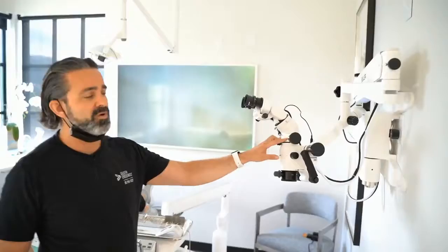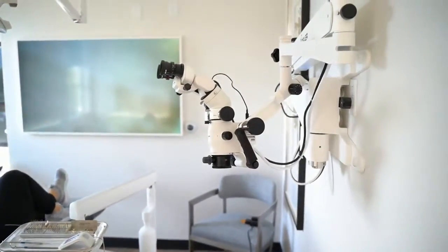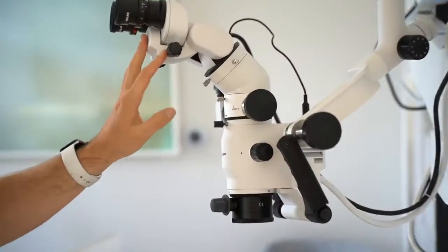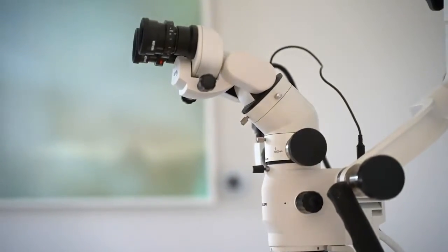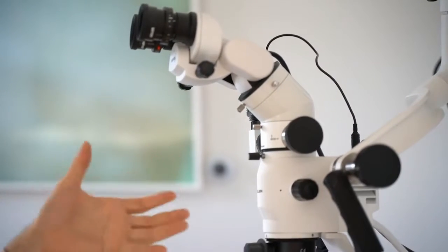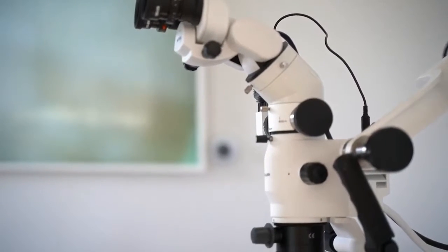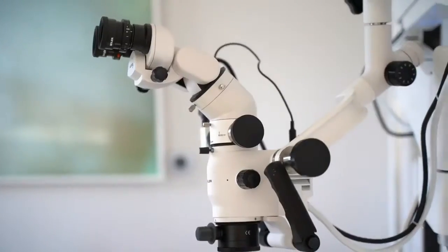Like I said, this Seiler beam splitter was a huge selling point to me. I'm not afraid to turn things upside down. That was important because I liked my shoulders not bench pressing or military pressing, and once I was able to flip that around, the scope became very comfortable for me. I think we all drive in our driver's seat in a car differently, how we posture our seats.